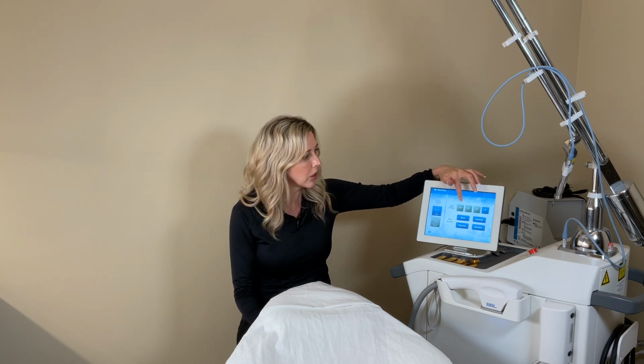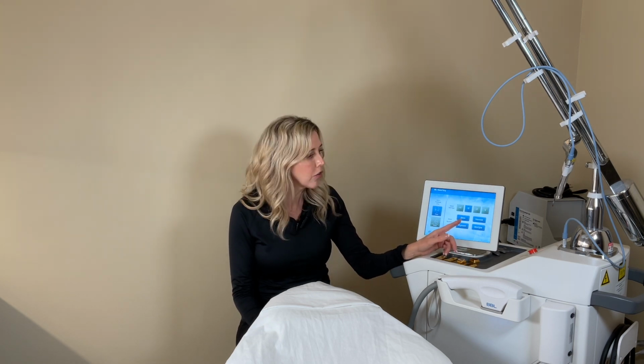So that's that Fitzpatrick scale that I said was so important. So if I choose someone's Fitzpatrick scale, then there are several passes that we go through. The first pass is the base pass, and that is really kind of a warm-up pass. I use the base pass twice. I start in the face and move across horizontally, and then I come back and do everything vertically to make sure I get everything done.